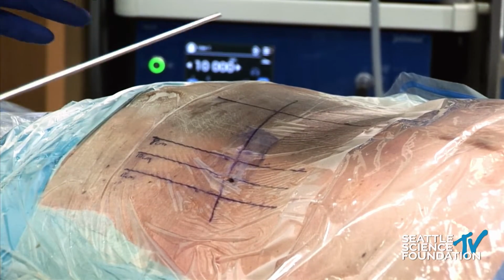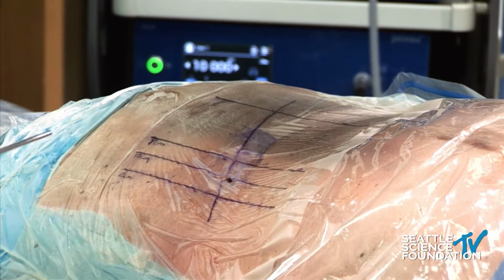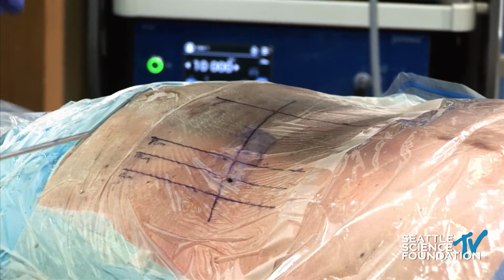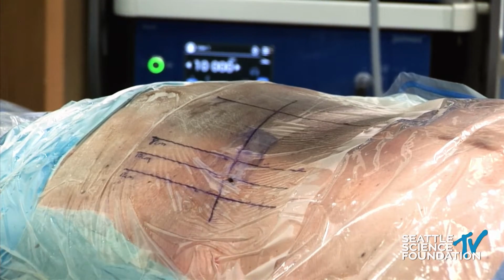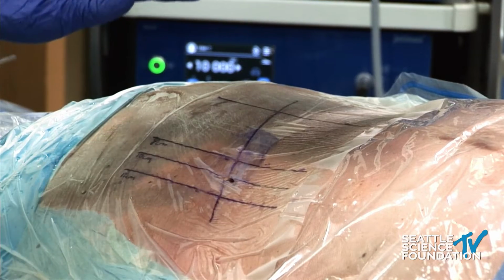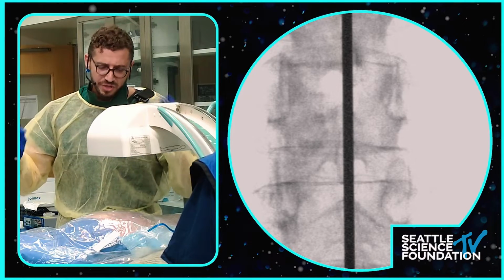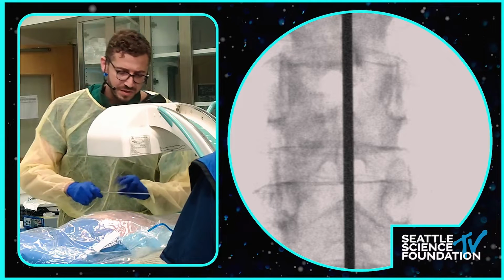After you do that, you want to see what your approach angle is going to be. There are many ways of looking at the approach angle. What I do is look at where the lesion is. Is it a migrated disc inferiorly, superiorly? Do we need to go more medial, which means I want to start more lateral?